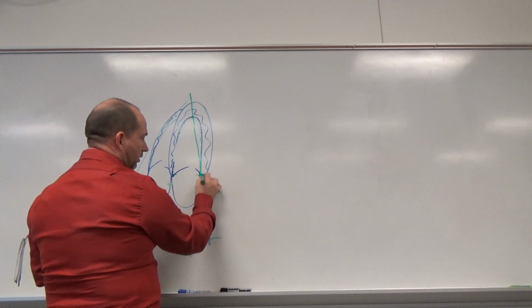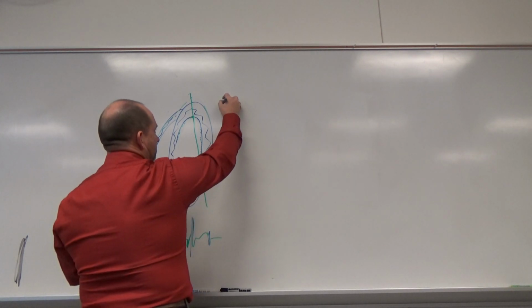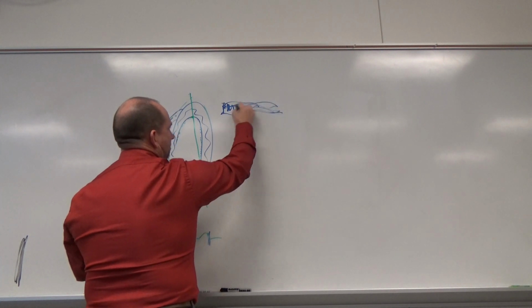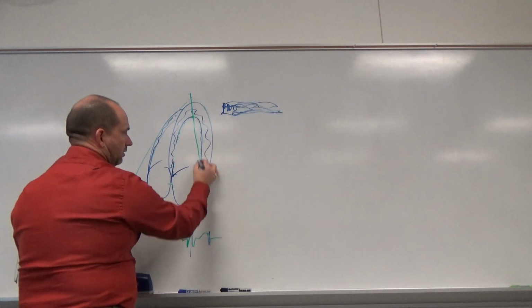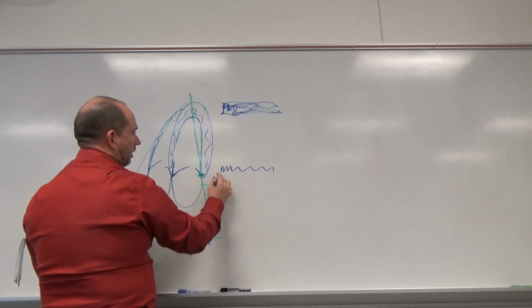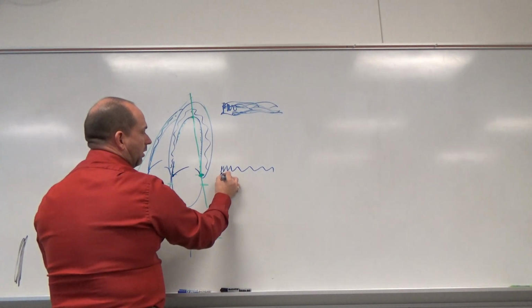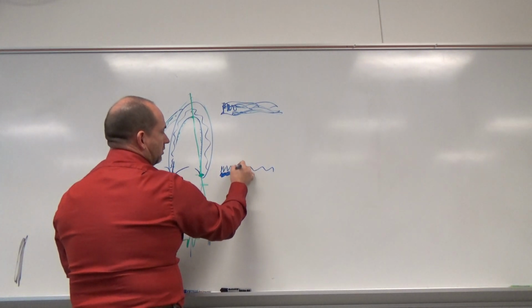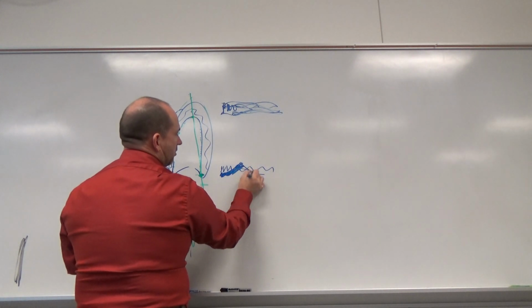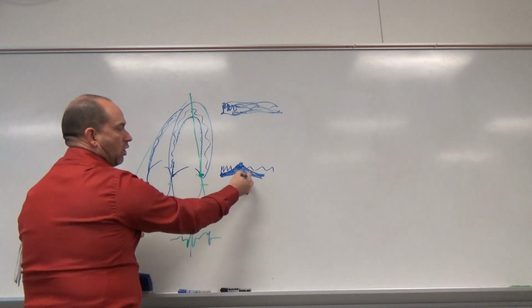And what we're looking for here is you're going to see the M mode is just going to show this. You're going to see a bunch of stuff up here, as it goes across the M mode. That's this. Then it hits this next interface here, so you might see some light shades of gray as it's going across. But we're looking for this annulus, which is going to be a darker signal. But it's going to come across, and then it's going to come up. Like this. It's going to raise and fall.